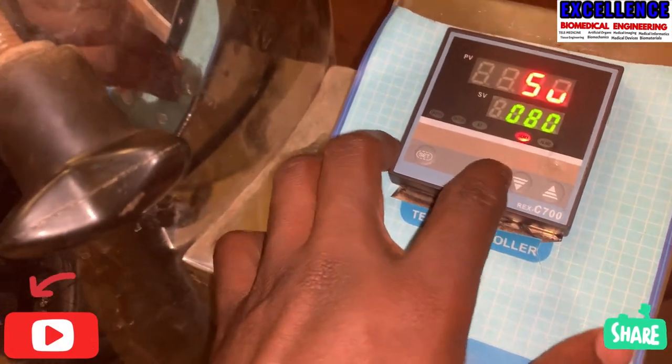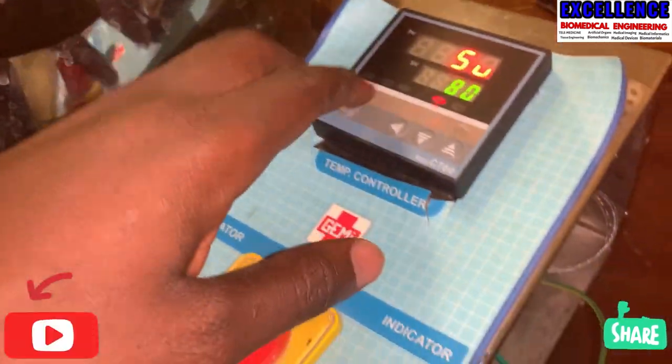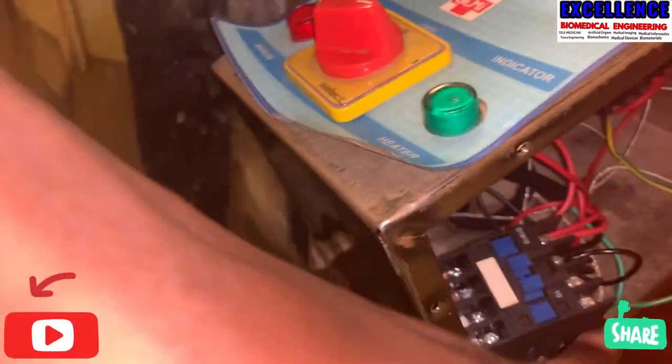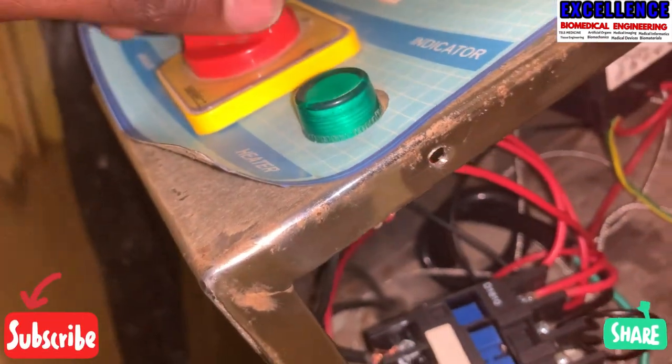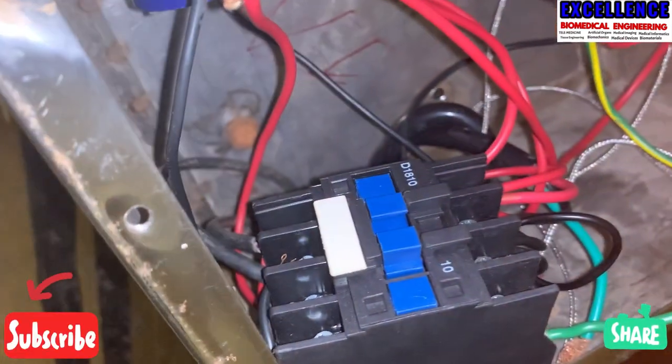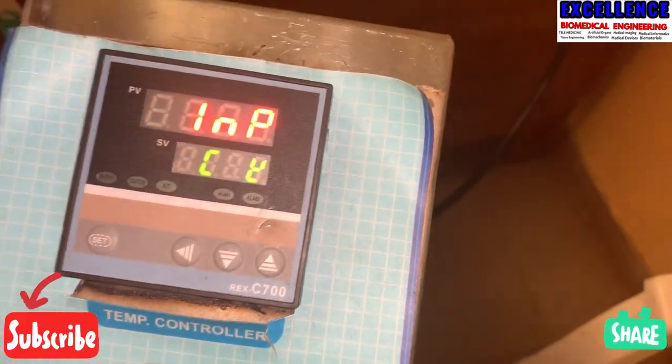If the controller is coming on but the contactor is not energizing, for example, let's say we want a temperature of 180 degrees — the contactor will definitely be energized at that setting. Now we switch it on, and you can see it is now energized by the controller.